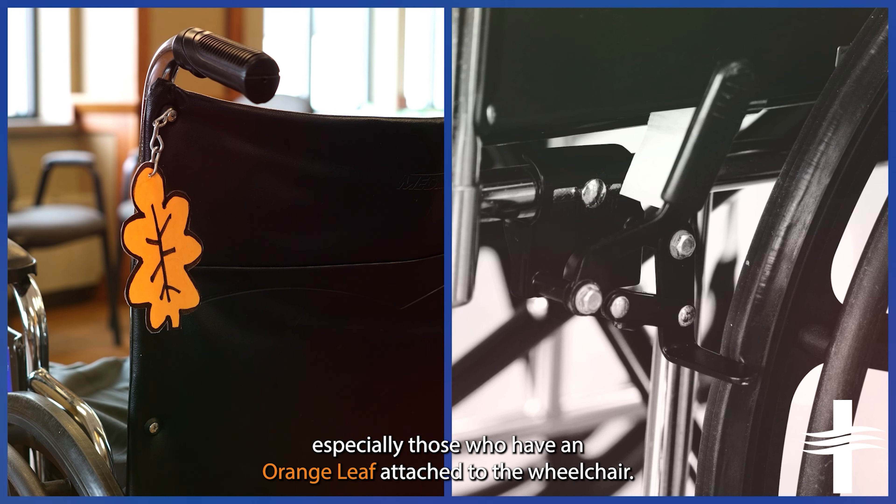Please take the resident to the family room or the kitchen area. This reduces the chances of the resident falling. Let a staff person know that the resident is back in the household. If the resident insists on returning to their own room, please let a staff member know. Make sure the resident can reach their call button.